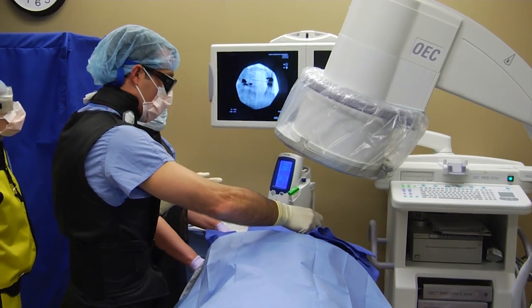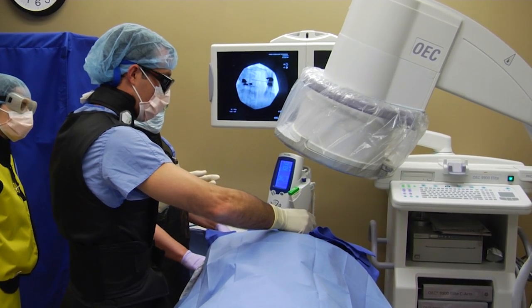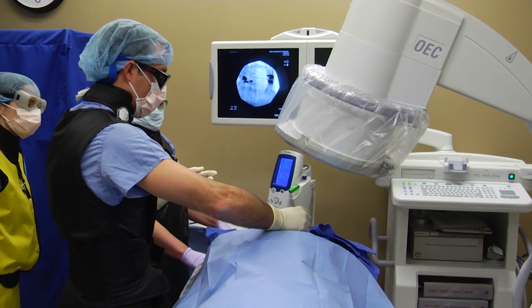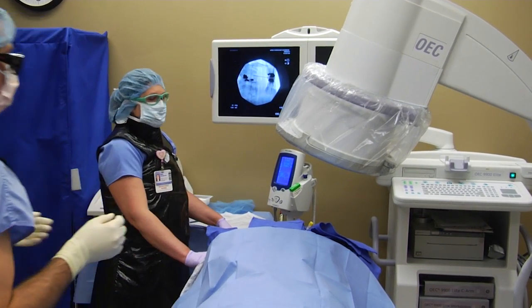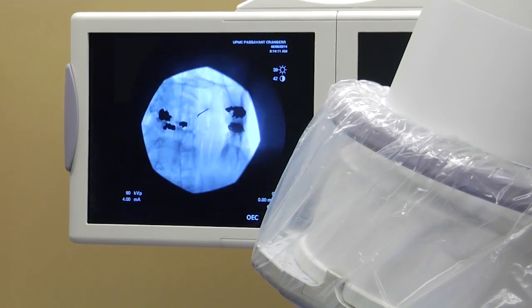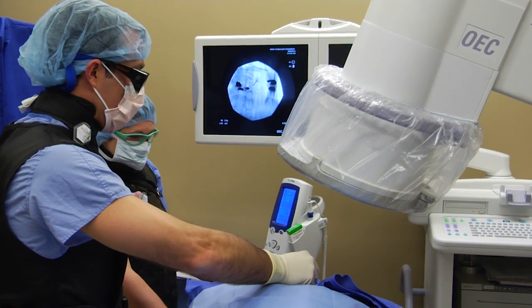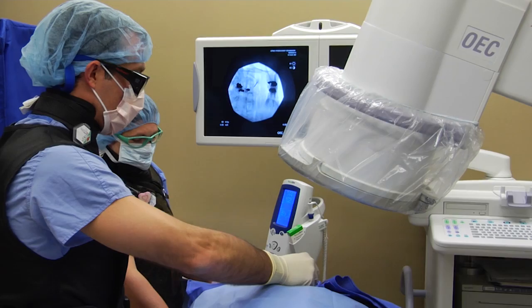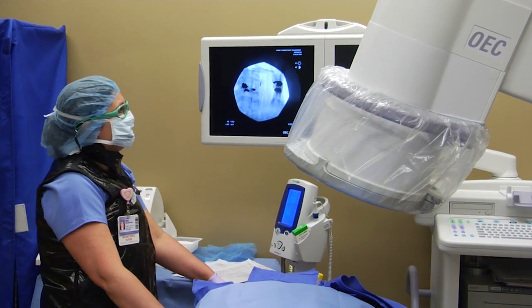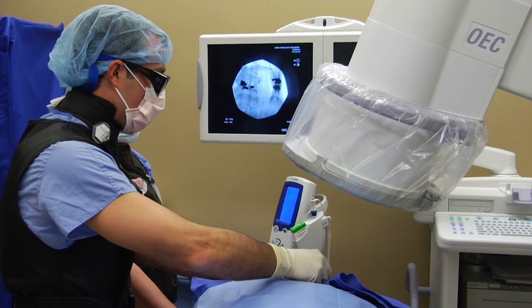First, I anesthetize the superficial skin with preservative-free lidocaine. Then, I insert a 20-gauge, 10-centimeter curved RFA needle through the skin. Under continuous fluoroscopic imaging, I am advancing the needle down to the target location. The notch on the RFA needle should always be positioned medially in order to avoid advancing the needle too far anteriorly.